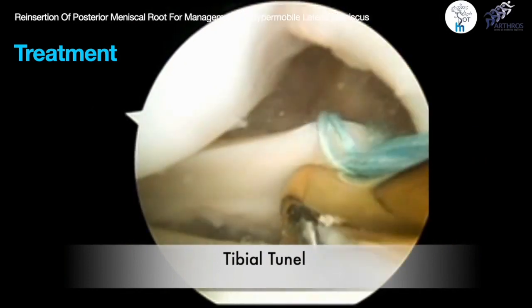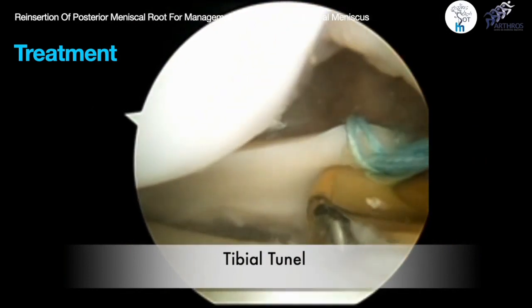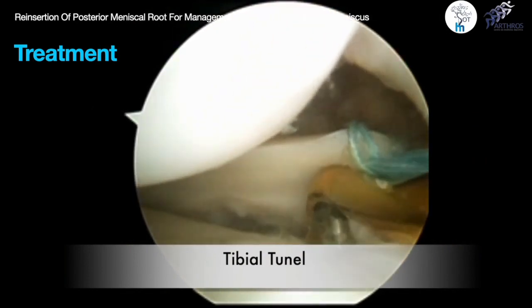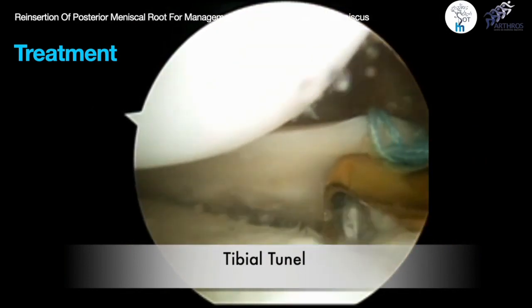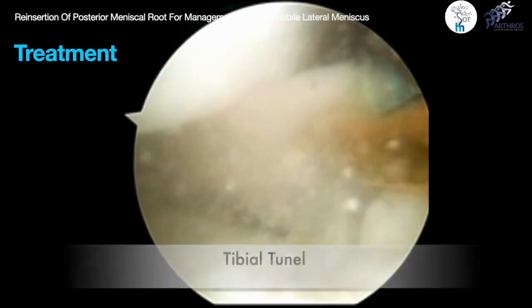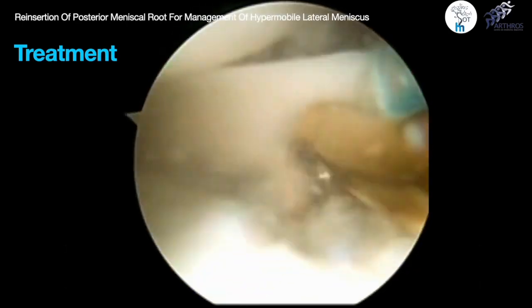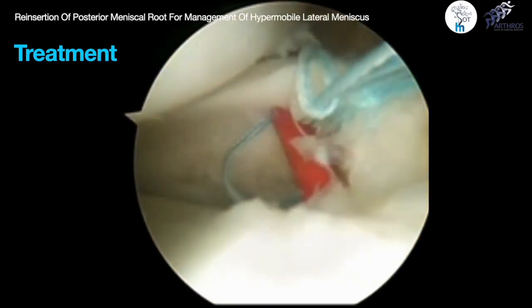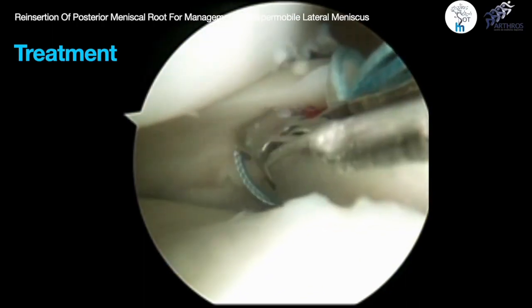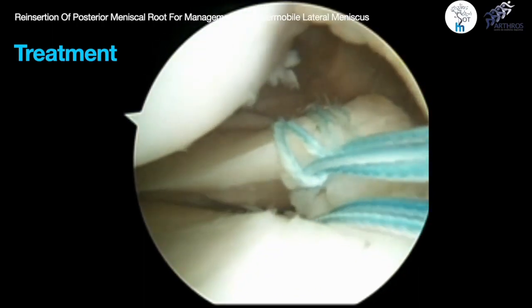We place a 2.4 mm guide pin. After that, we create a tibial tunnel using a 4.5 mm drill. The meniscal sutures are then retrieved through the tibial tunnel.